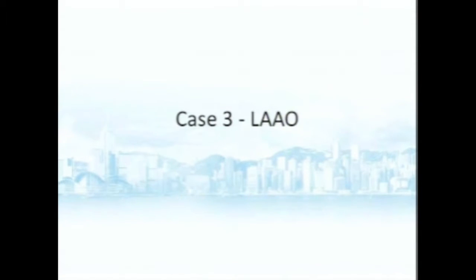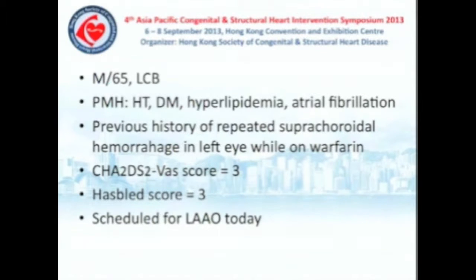Next slide, please. This is a 65-year-old gentleman who has a known history of hypertension, diabetes, hyperlipidemia, and atrial fibrillation. He has a previous history of repeated suprachoroidal hemorrhage in the left eye while on warfarin. Therefore, warfarin has been stopped. The CHA2DS2-VASc score is 3 and the HAS-BLED score is 3. So he was scheduled to have LAAO today.